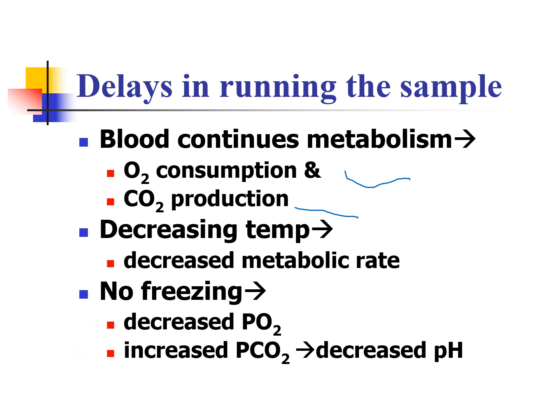Decreased temp and increased temp. Decreasing the temp will decrease the metabolic rate. That's why we put these in a little bit of ice bath. We don't want to freeze them. We're not going to put it in a freezer or a refrigerator. You're going to put it in a bag that has an ice slush to it, or follow the policies of that hospital. They do make glass syringes still where you don't have to do that because it actually stops the metabolism or slows it down as long as you run it within 15 minutes or so. So just pay attention to the hospital you're at.